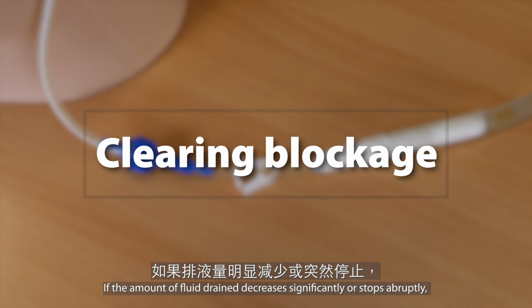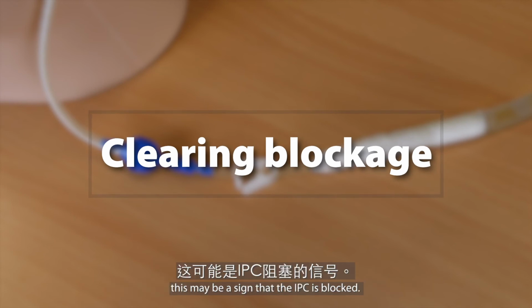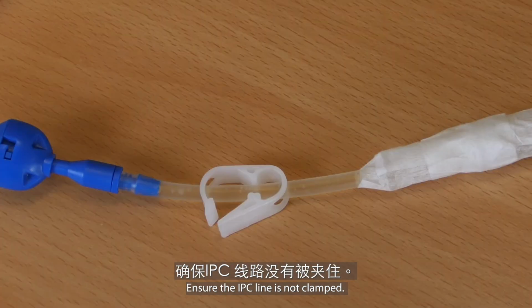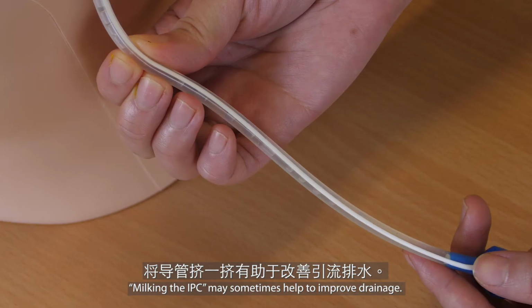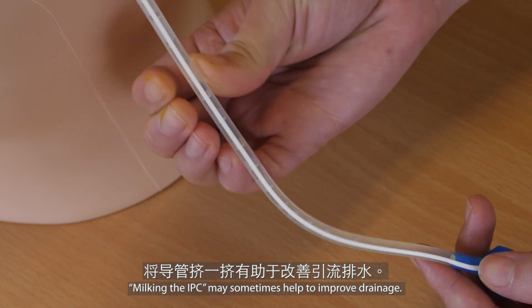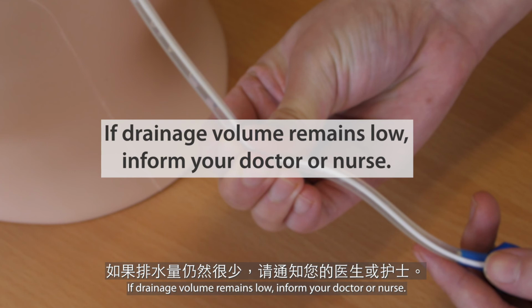If the amount of fluid drain decreases significantly or stops abruptly, this may be a sign that the IPC is blocked. Ensure that the IPC line is not clamped. Check that the IPC or tubing of the drainage bag are not kinked. Milking the IPC may sometimes help to improve drainage. If drainage volume remains low, inform your doctor or nurse.